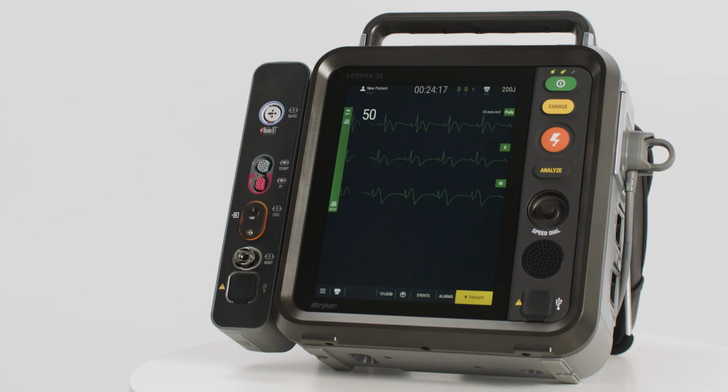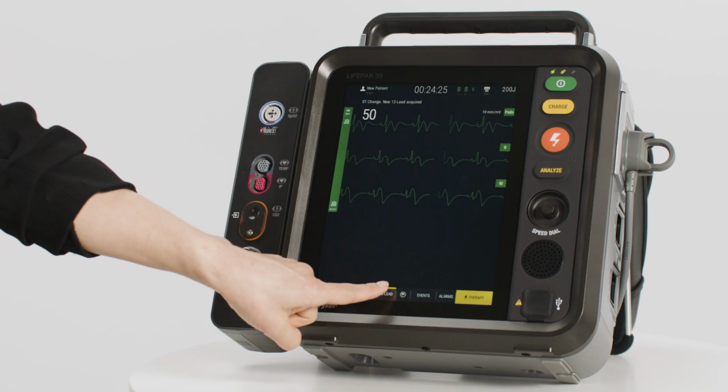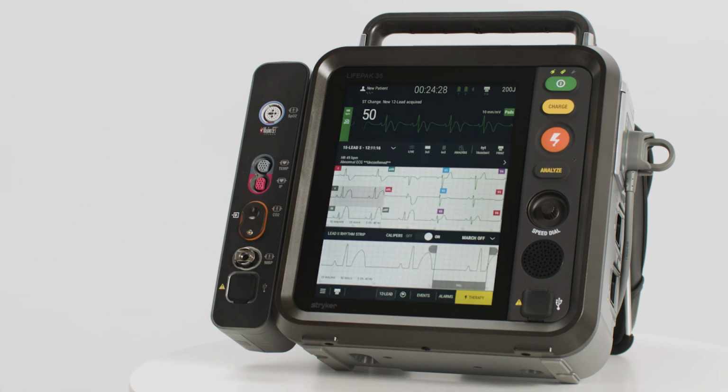After acquiring an initial 12-15 lead ECG, and with the leads still connected to the patient, the LIFEPAK 35 device will automatically check and graph the patient's ST segment every 30 seconds. If a change that is greater than or equal to 0.1 millivolt is detected and lasts longer than 2.5 minutes, the device will automatically acquire, show an alert message, and print, if available, a new 12-15 lead ECG. Should a new 12-15 lead be acquired, a message stating "ST change, new 12 lead acquired" will appear at the top of the screen. To view the new report, press the 12 lead button at the bottom of the screen.